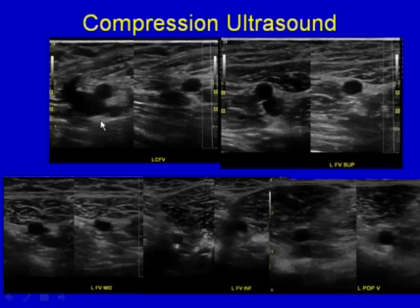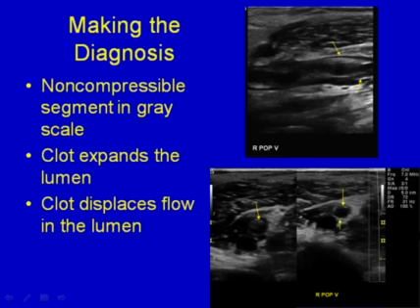So we tend to use just compression still images. It's a quick, easy way to record. So the left side of the image is the distended vessels, and as we compress, you can see that the veins go away. This is just a little bit of muscle here, and the artery is left behind. Again, vein and artery, artery left behind, and that goes all the way through down to the popliteal.